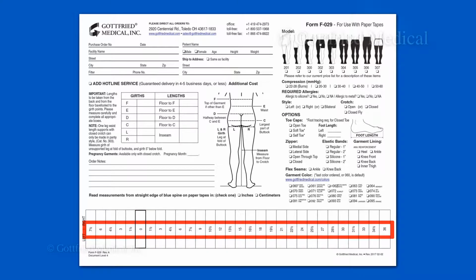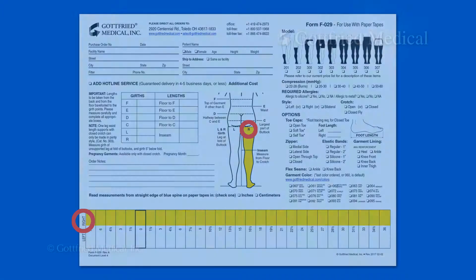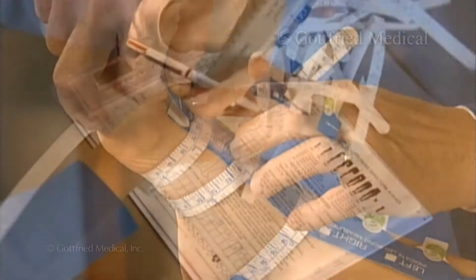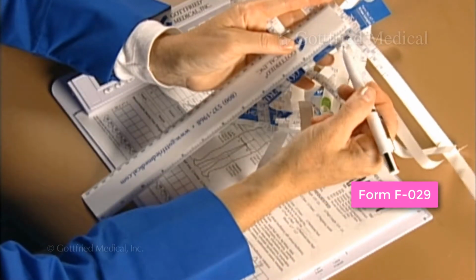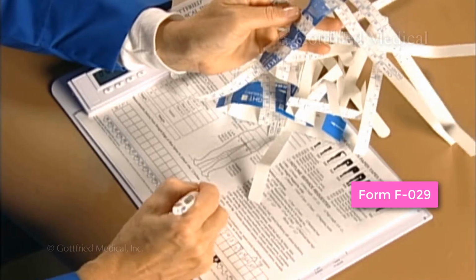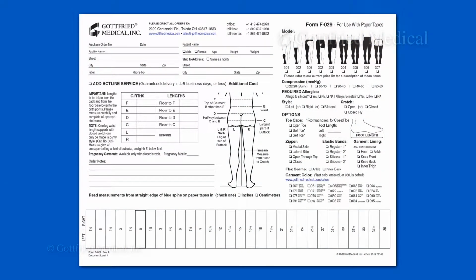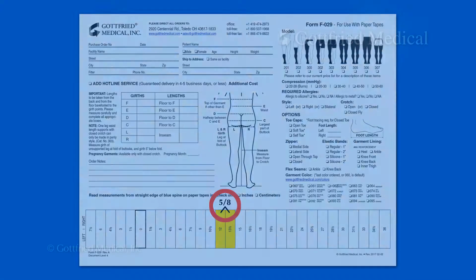On the form are numbers that correspond to the straps on the tape. Record the measurement in the box above the 0. The bottom row is for the left leg, the top row for the right. Wherever there is a pleat, measure the distance between the center lines of the 2 straps that are now closer together. Record it on the form between the numbers of the appropriate straps. For example, the pleat between straps 12 and 13.5 measures 5/8 inches.